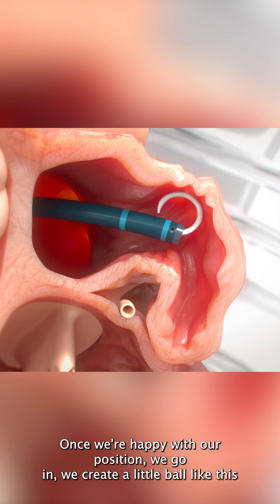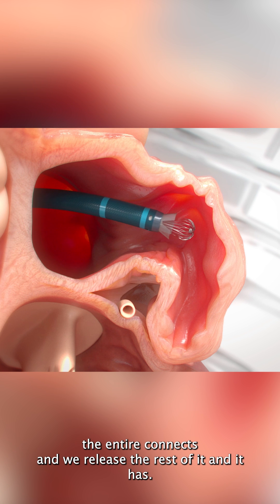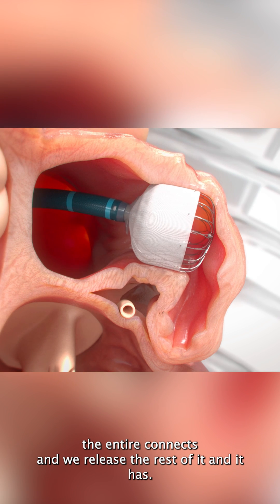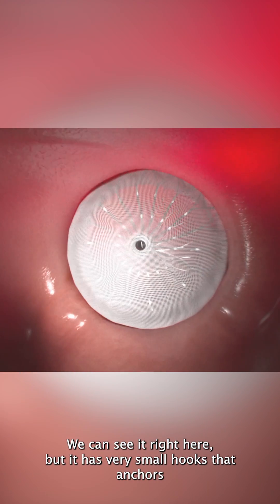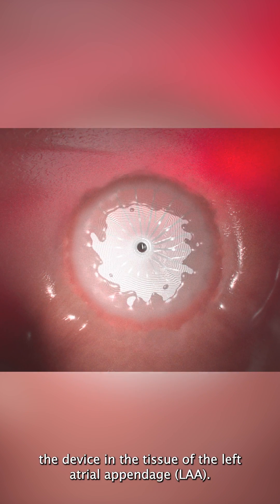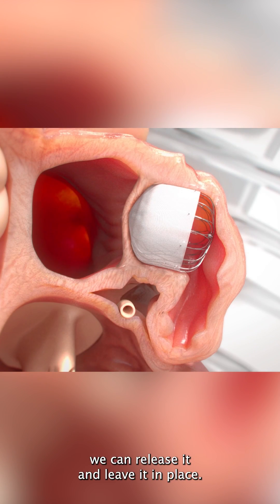Once we're happy with our position, we go in and we create a little ball like this and we position it in a good way to make sure that we plug the entire appendage. We release the rest of it and it has — we can't see it right here — but it has very small hooks that anchor the device in the tissue of the left atrial appendage. Once we are happy with the device, we can release it and leave it in place.